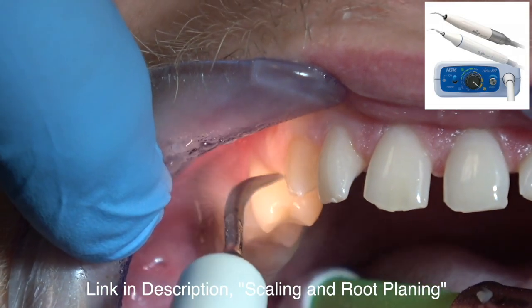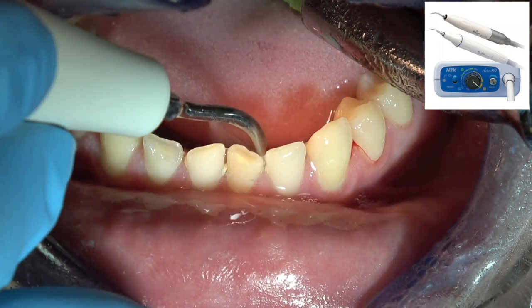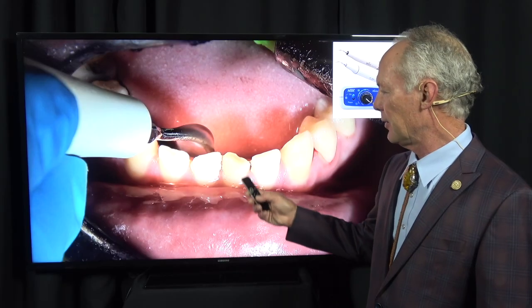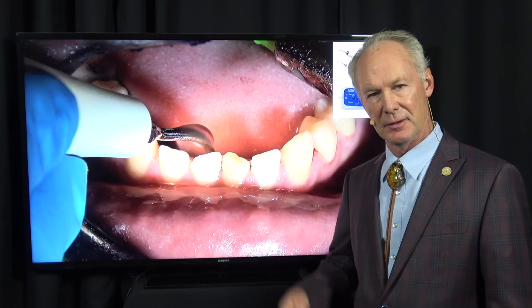So the first thing we're doing is deep cleaning. You'll remember in the pre-op photographs, he had lots of calculus on the teeth. And so the way we do deep cleaning in my office, while I don't like to anesthetize all four quadrants of a patient when they're wide awake in the hygiene room, that's just a bad first impression of our office and dentistry. So I prefer to do the gross debridement while the patient is sedated and they're not even going to know they've been anesthetized, and get most of the things off with an ultrasonic scaler, and I'll do some hand scaling and possibly some polishing at this appointment. Then my hygienist sees them for the fine scaling and oral hygiene instruction.